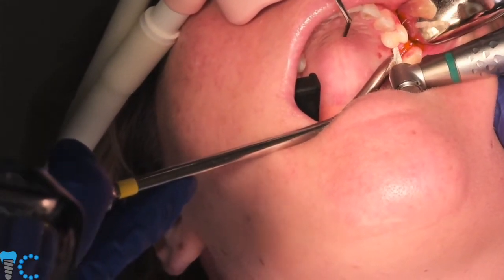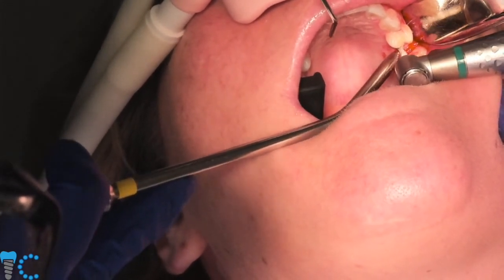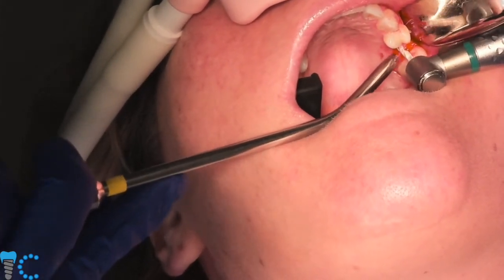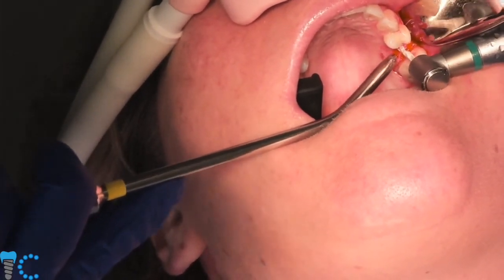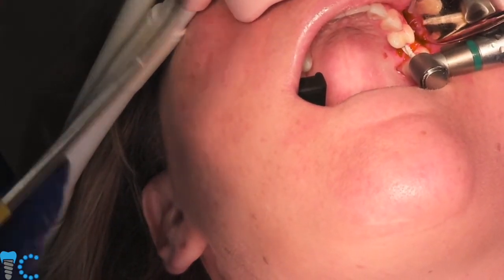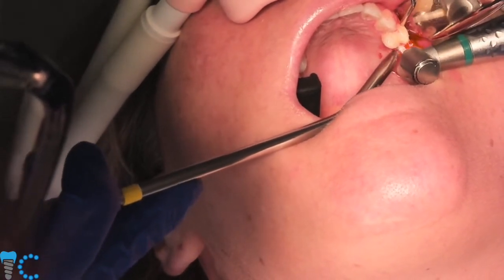I'm going to go in at a little funky angle just to get a pilot hole. And then once I've established the pilot hole, I'm going to take my implant drill back out, and then I'm going to reorient for the real angulation that I want. And now we're off to the races.